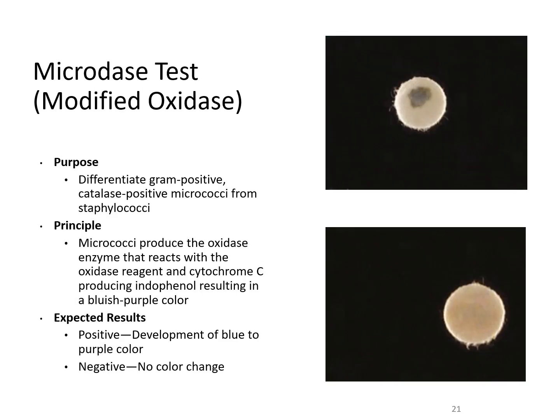You also have the modified oxidase test. With this, you're looking for a positive result of a blue to purplish color, as demonstrated at the top, or no color. Don't mistake the actual drop of the reagent that puts a tinge on the disc as any sort of color change, but you're looking for no bluish purple color for a negative reaction.